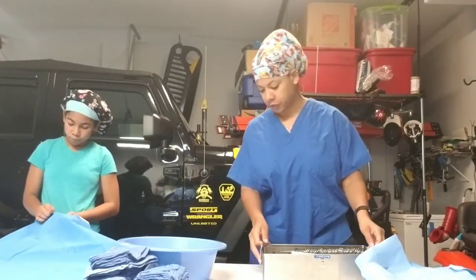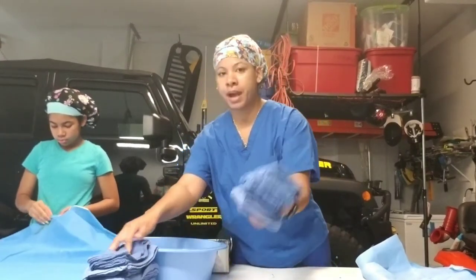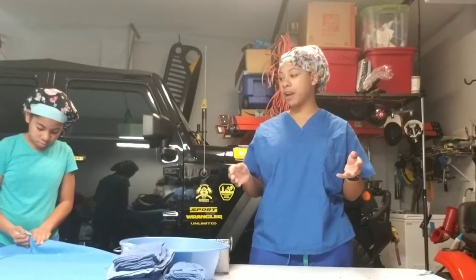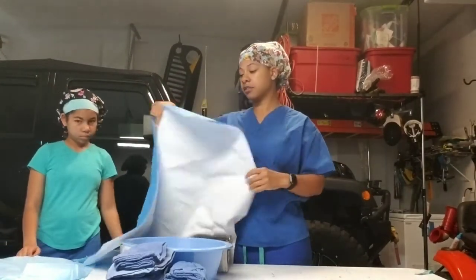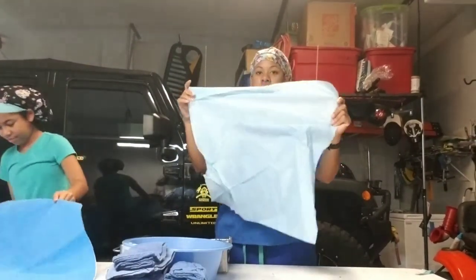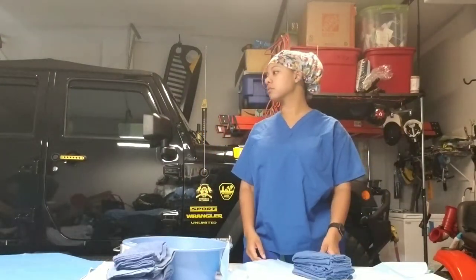We're going to be envelope wrapping — an instrument tray full of instruments, a basin set, and a four-pack and eight-pack of towels. When envelope wrapping, the first thing is to obtain your wrap. It's called a chem guard; they come in different sizes and plies. This double, extra-thick version and the single, thinner version are both effective. You need to know the size based on what you're wrapping.